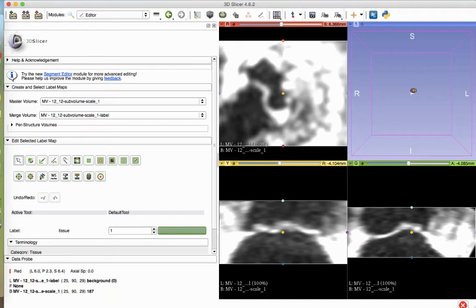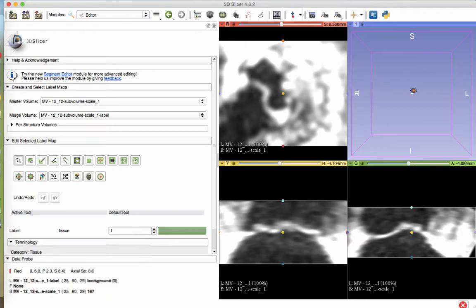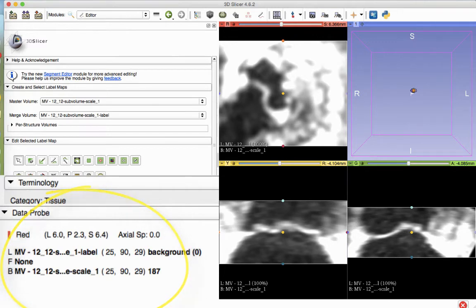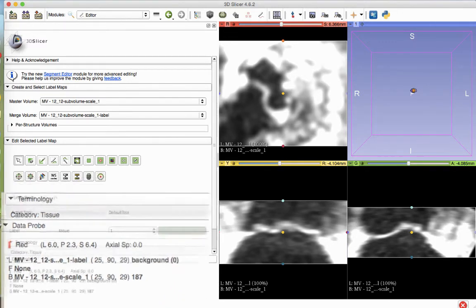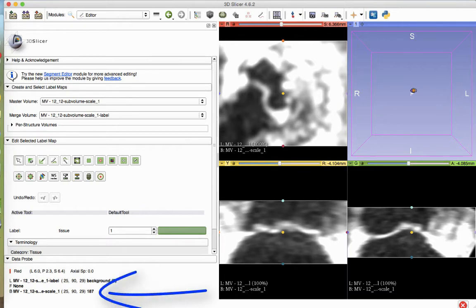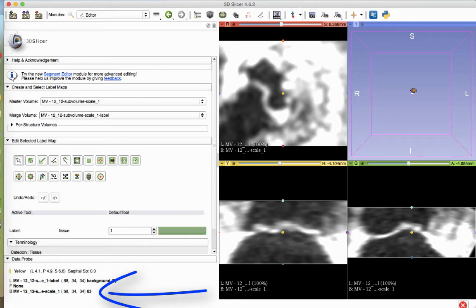To threshold the volume, mouse over the area that you desire to print. As you mouse over the images, you will notice changing numbers under the Data Probe heading towards the bottom left of the screen. The number of interest for the purpose of thresholding is at the end of the B row in bold. Appreciate the number that correlates with the lowest value included in the tissue that you desire to print. The value is generally in the 60-70 range.